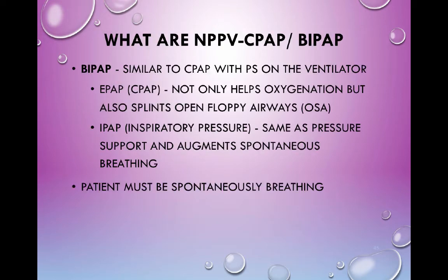Okay, BiPAP. So BiPAP is CPAP with a breath. So we have a continuous positive airway pressure, not PEEP, CPAP. And then we have PAP, positive airway pressure or pressure support. So this is all the same stuff that we talked about in our pressure support ventilation. It's a CPAP with a pressure support. It's really the same stuff. It's just a mask, so they gave it a different name. And I think I saw in an article they do that just to confuse nurses.